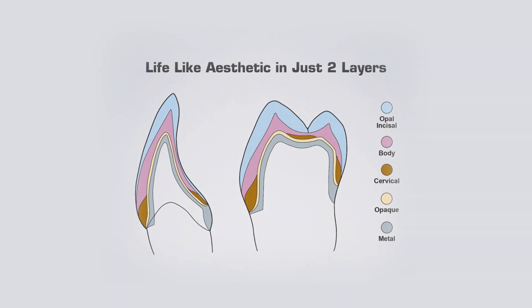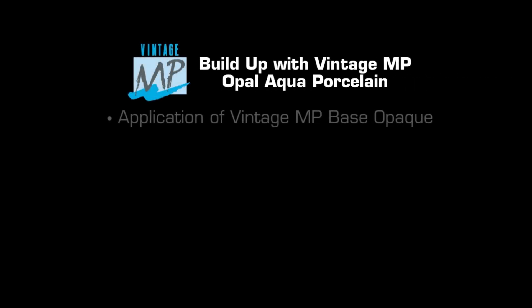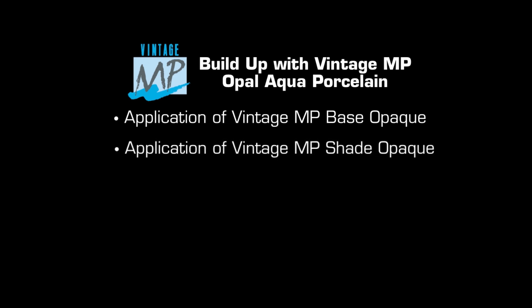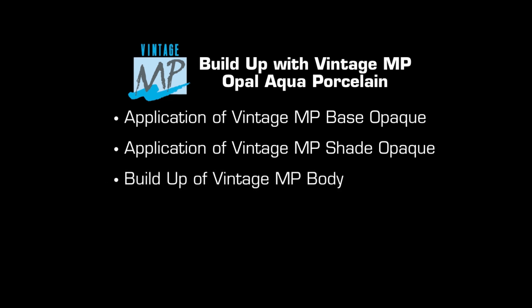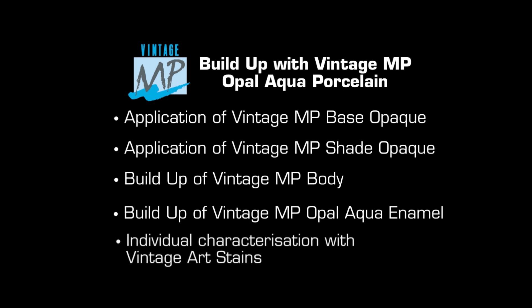Buildup of anterior crown with Vintage MP Opal Aqua porcelain in metal ceramic restorations. Step 1: application of Vintage MP base opaque. Step 2: application of Vintage MP shade opaque. Step 3: buildup of Vintage MP body. Step 4: buildup of Vintage MP Opal Aqua enamel. Step 5: individual characterization with Vintage Art Stains.